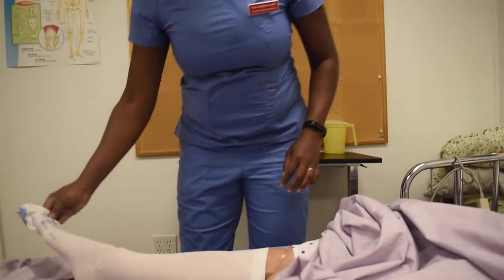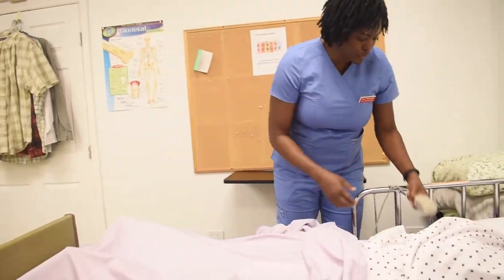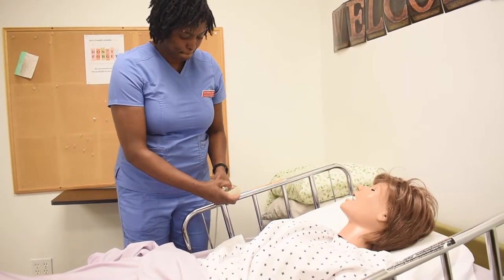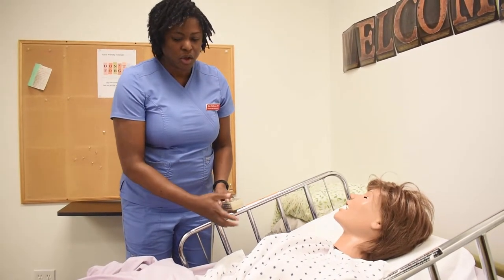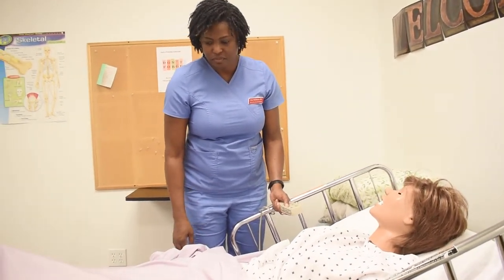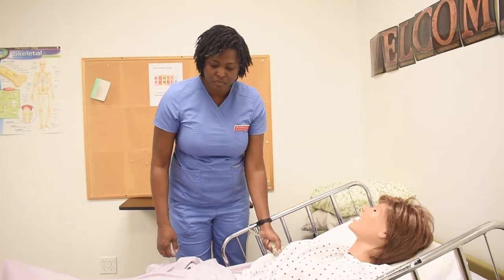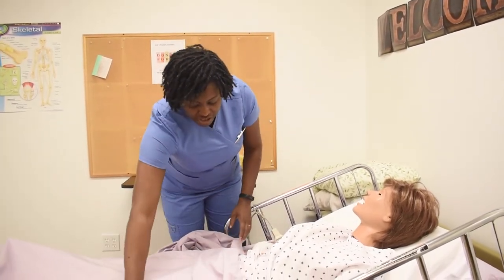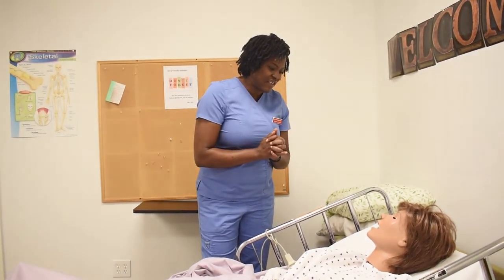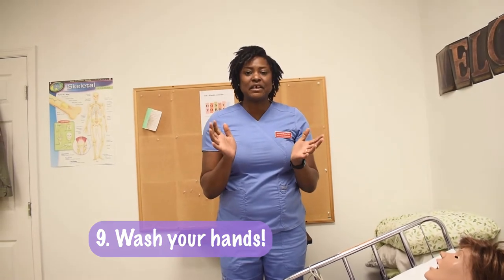Make sure that the heel is on the heel. For our skills test we want to make sure there are no wrinkles. We cover her up and we can lift her head back up. Lower the bed. Make sure that her call light is near her — here's your call light, call me if you have any concerns or need anything. I wash my hands and my skill is complete.